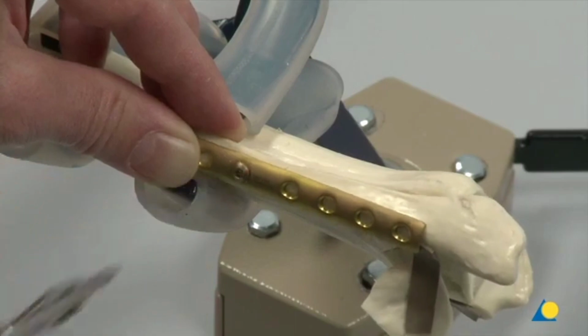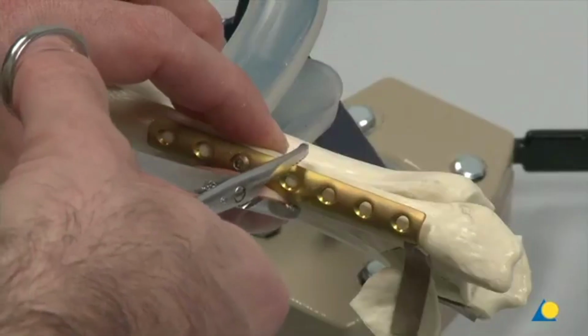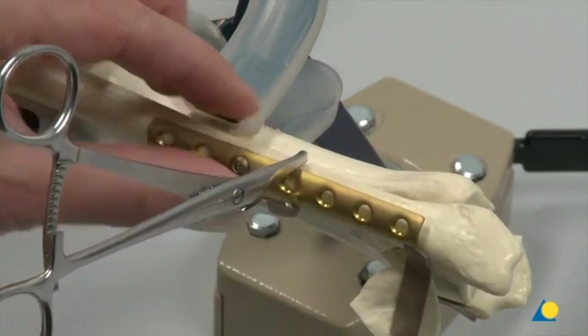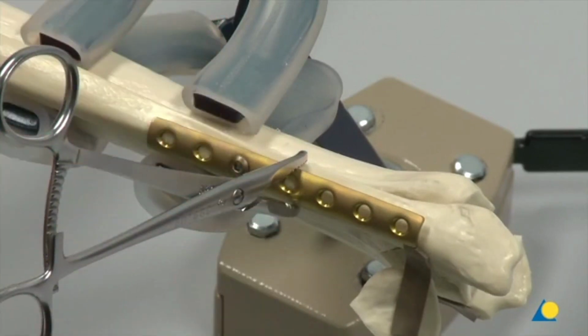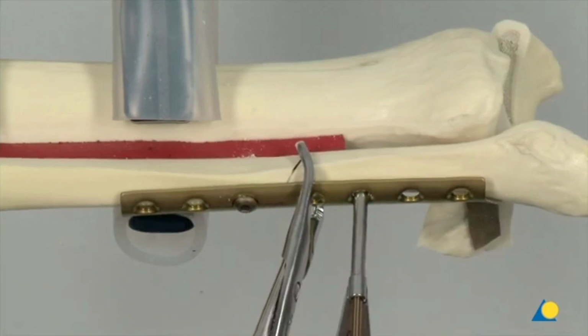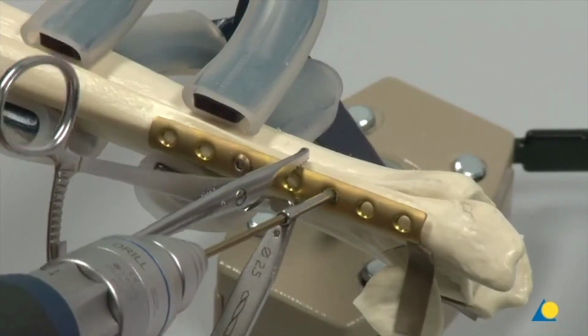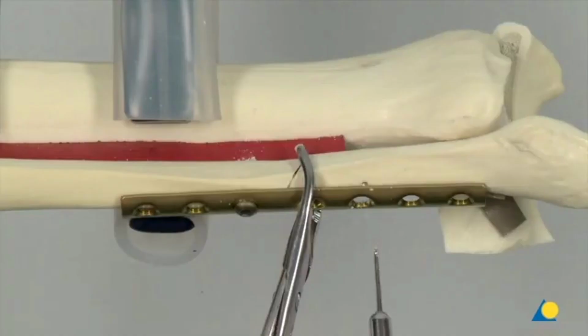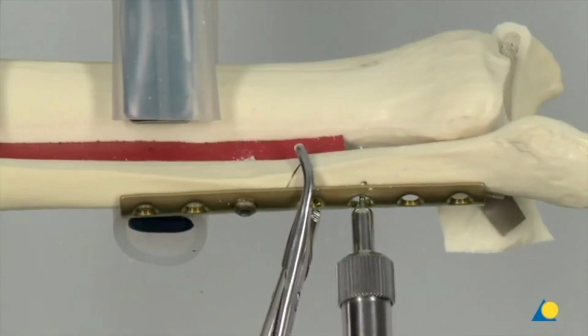A final fracture reduction is performed over the plate using the toothed reduction forceps. Clinically, pointed reduction forceps can also be used from a mediolateral direction, however this requires more soft tissue dissection. The 2.5 mm drill bit is used to drill eccentrically through the third distal plate hole. The depth gauge is used to measure the required screw length.